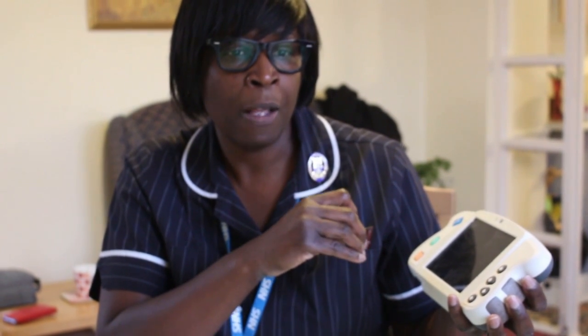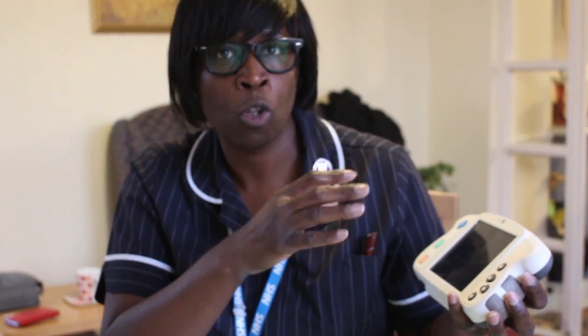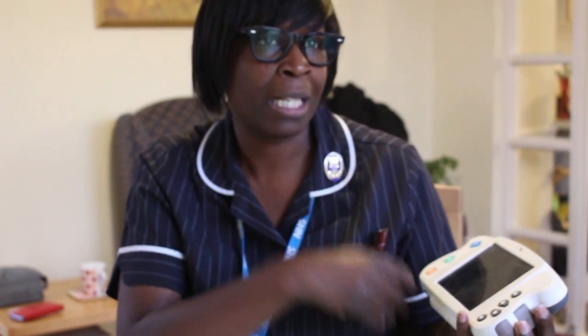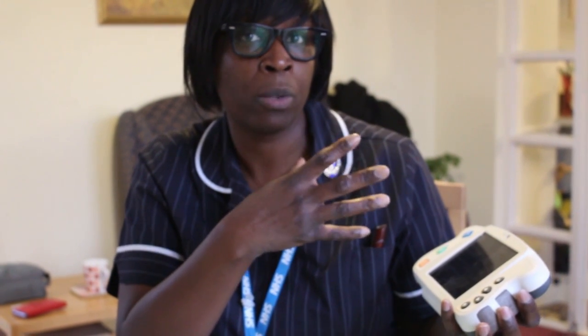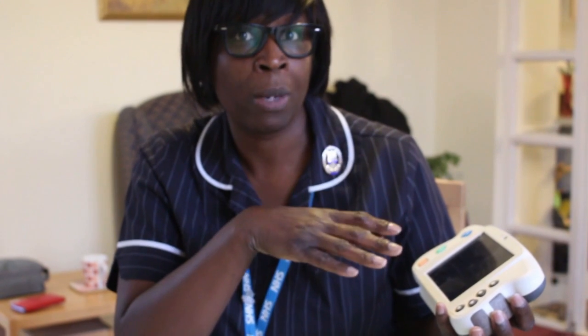So if the prompt questions or the vital signs are outside the normal parameters, then I would get an alert. The system will send an alert through my mobile phone, and it will come to me via email, which other matrons can also access. And then we'll be able to ring the care home first, just to ask more about the patient, and then arrange a visit usually within 2 to 4 hours.